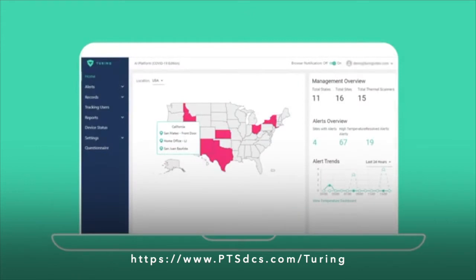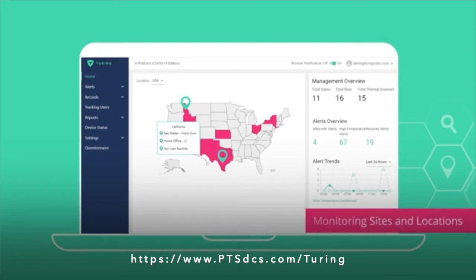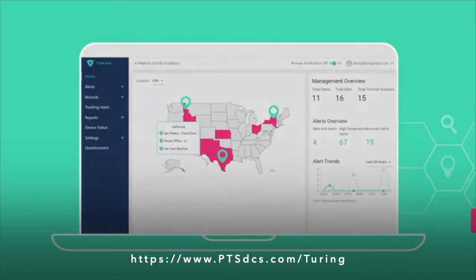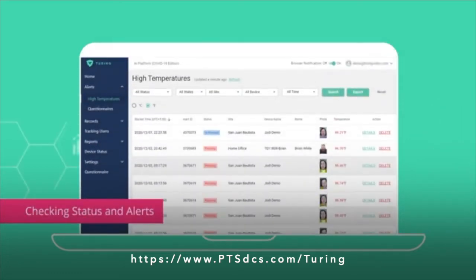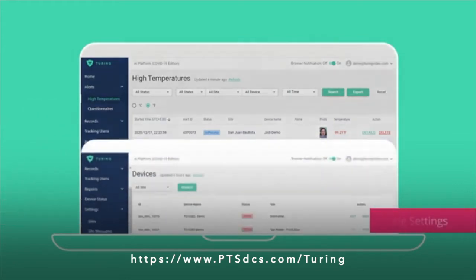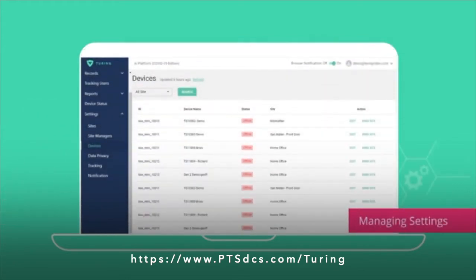Using the Data Access Management Platform, you can perform an array of tasks, from monitoring sites and locations to checking various statuses and alerts, viewing reports, managing various settings including sites, devices, notifications, and much more.